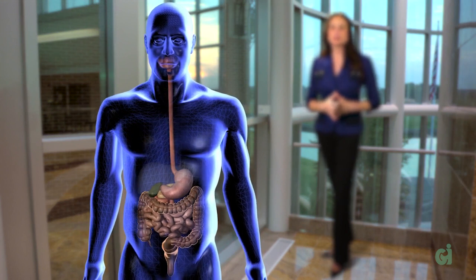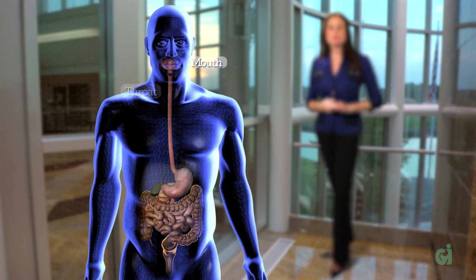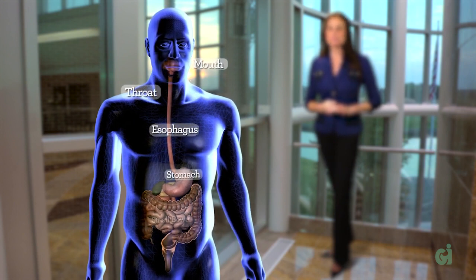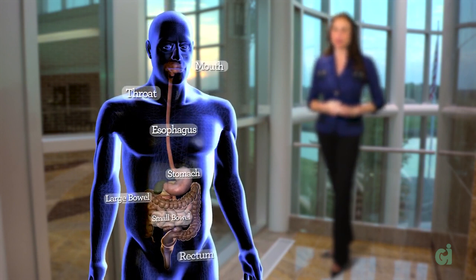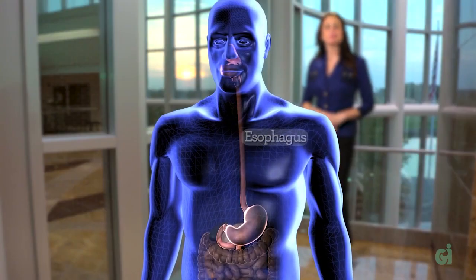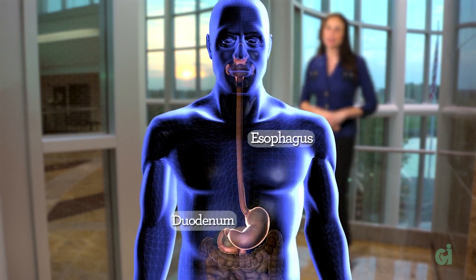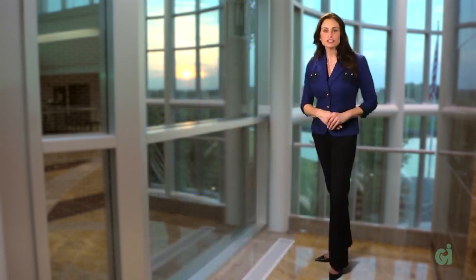This system is also known as the gastrointestinal tract, GI tract for short. It includes the mouth, throat, esophagus, stomach, small bowel, and large bowel, which ends in the rectum. The upper GI tract is the part of the system that begins at the esophagus and ends at the upper part of the small intestine called the duodenum. EGD allows doctors to look inside the body's digestive system through the use of an endoscope to examine the internal lining of the upper GI tract.